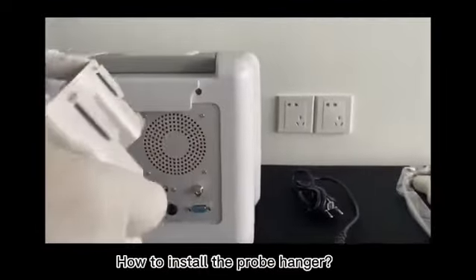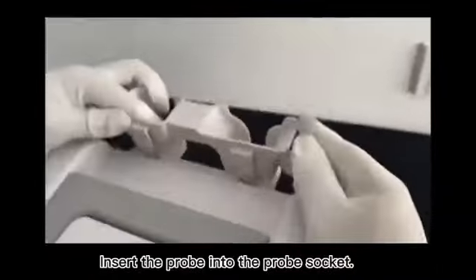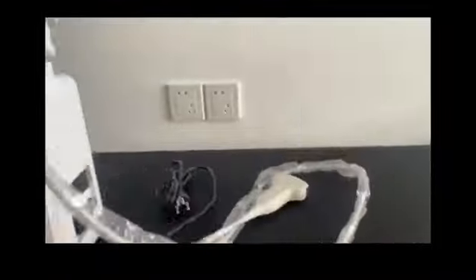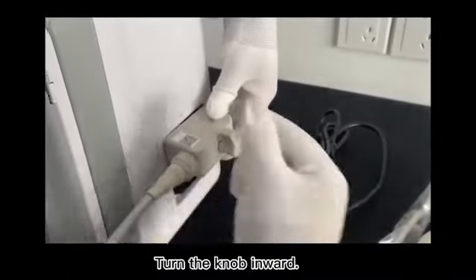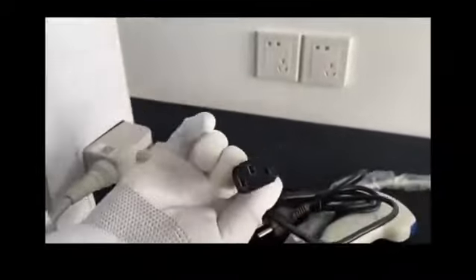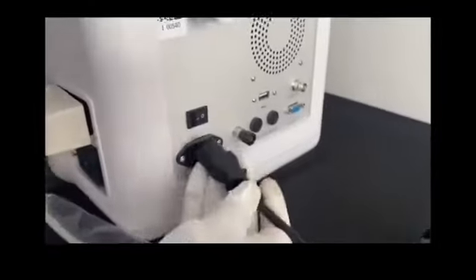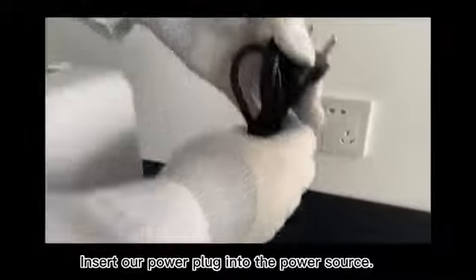How to install the probe hanger. Insert the two clips into the grooves. Insert the probe into the probe socket. Turn the knob inward. Finally, insert the power plug. Insert our power plug into the power source.